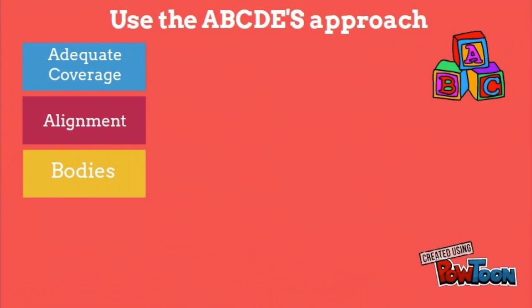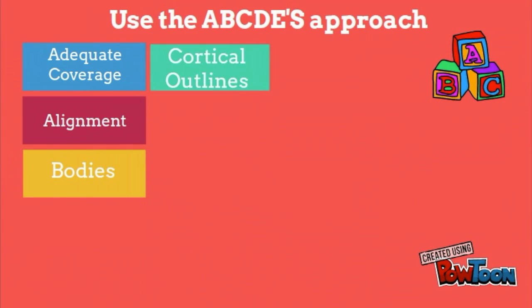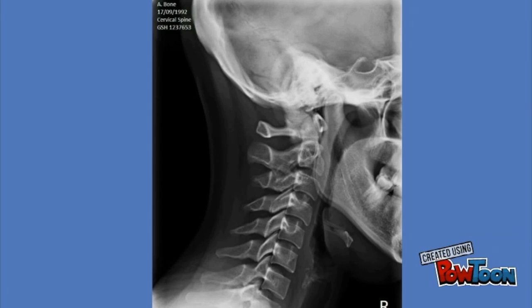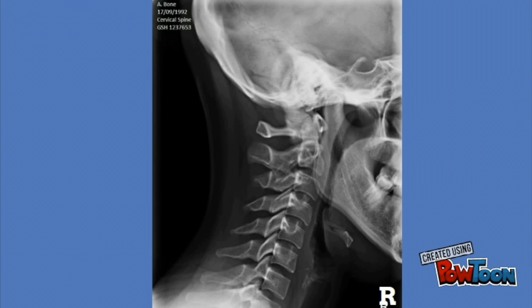B for Bodies, C for Cortical outlines, D for Disc spacing, and E for Edges and soft tissue. The following rules apply to the interpretation and presentation of all x-rays: always confirm the patient's identity and date of birth, then identify the type of x-ray and the specific view. Be sure to orientate yourself — there will usually be a small metal marker indicating either the right or left of the x-ray.